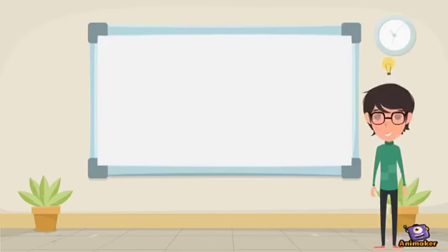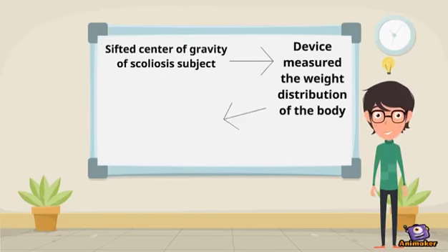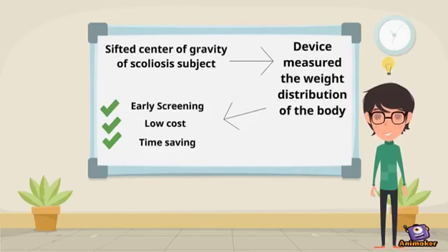So, by applying the concept of shifted center of gravity from the midline of the scoliosis subject, this innovation aims to design and fabricate a cost-effective device which helps to detect scoliosis on the subject.